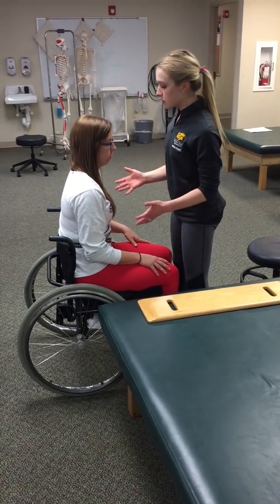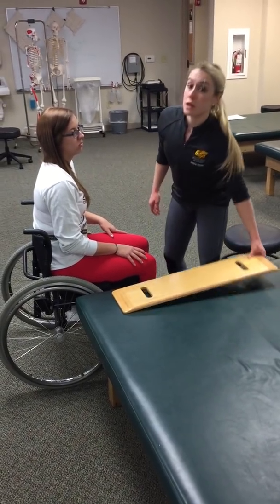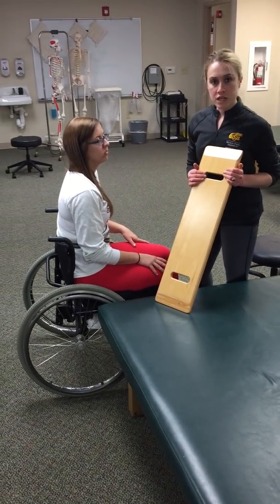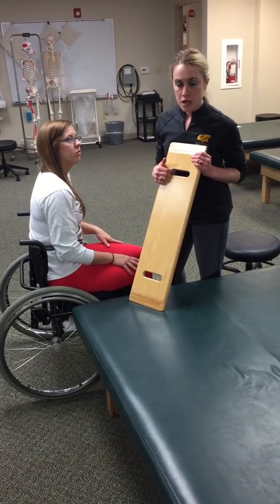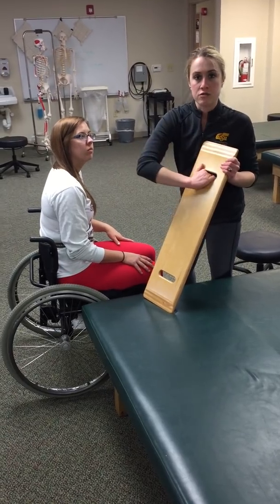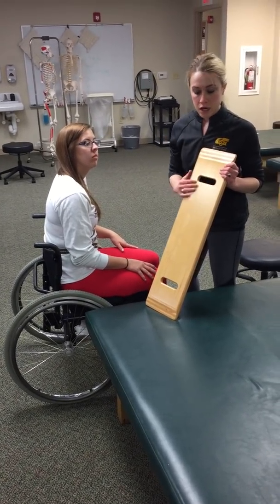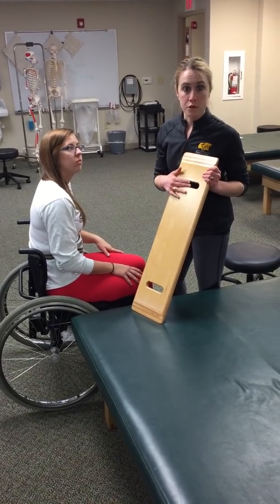What I'm going to do is tell Claire we're going to move over here to the table. We're going to use this board. One of the very important things about sliding board transfers, depending on the type of sliding board you're using, is making sure that the patient does not reach around to grab on the underside of the sliding board or reach around to grab on the inside of the handrest.